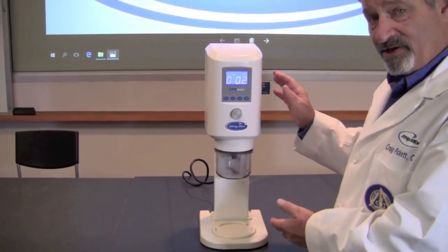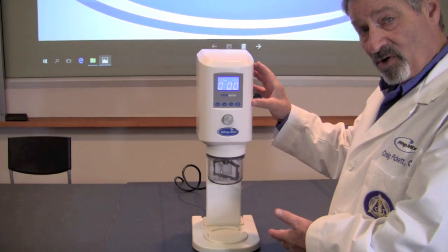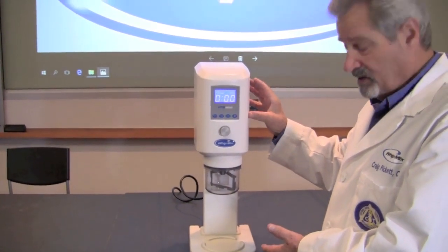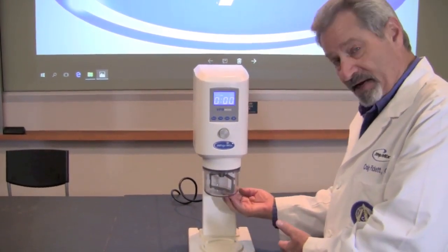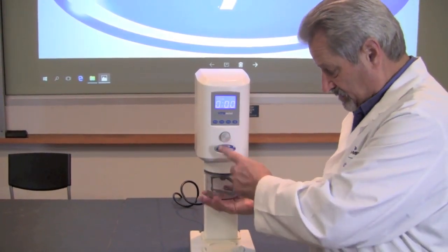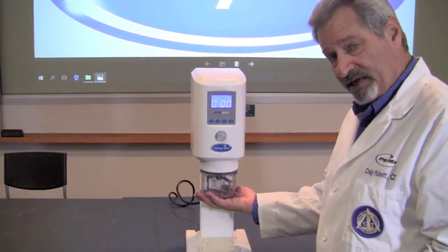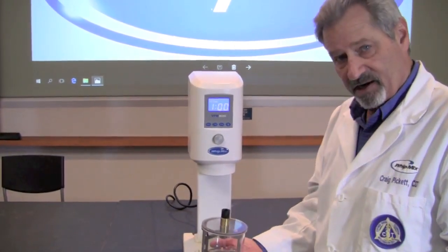As we come to the end of the program, the machine will beep to let you know that the program is completed, but it will hold the bowl in place with the vacuum. As soon as you're ready, place your hand under the bowl, press the silver button, and it will release the vacuum and release the bowl.